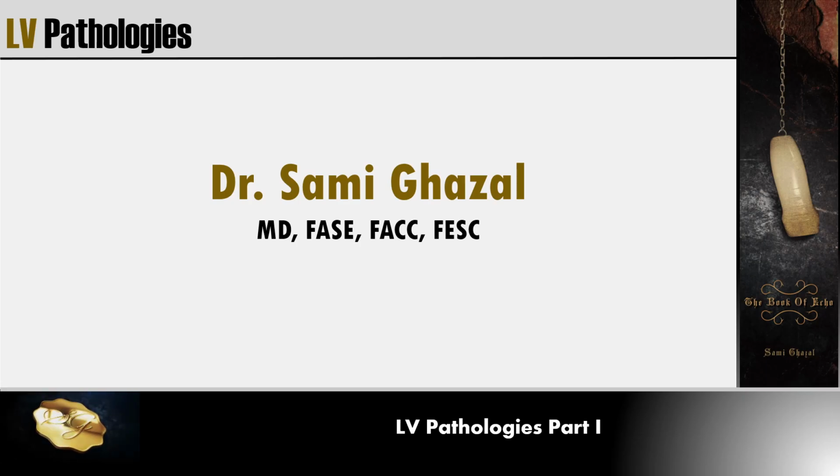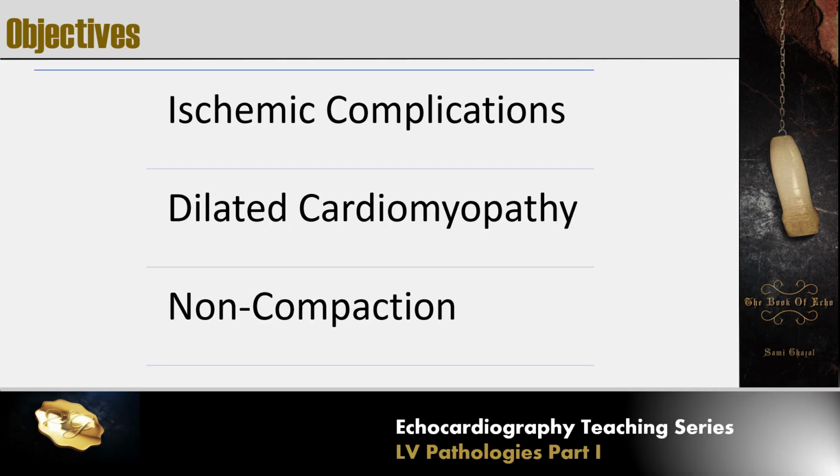Welcome to Echocardiography lecture series. This lecture will be about LV pathologies part 1. The objectives are ischemic complications, dilated cardiomyopathy, and non-compaction. The rest of pathologies will be covered in part 2.